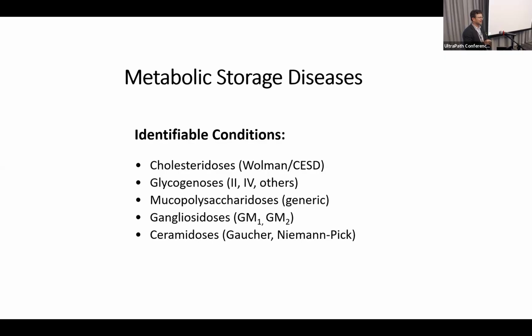But is it fair to say that in pediatric pathology there's a lot more respect for EM than there is in adult pathology, meaning even for tumors? Right, the characterization of the tumors becomes very, very important. And I think that's why most diagnostic EM labs, if they're not a renal specific laboratory, are going to be in a pediatric hospital, and that's kind of historical.